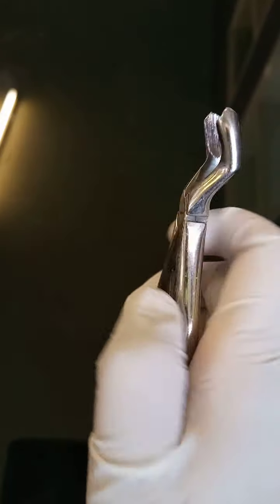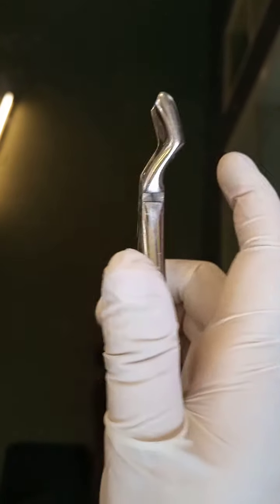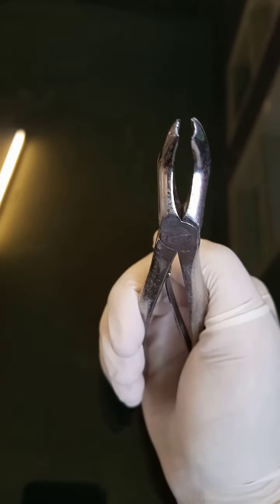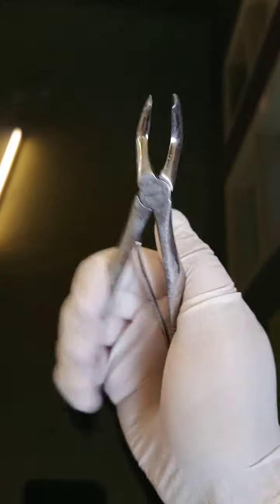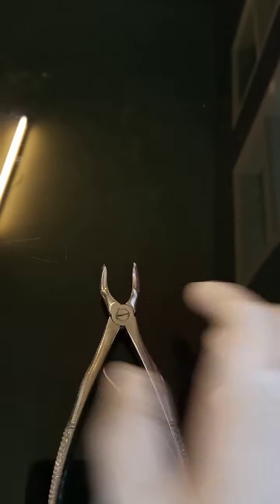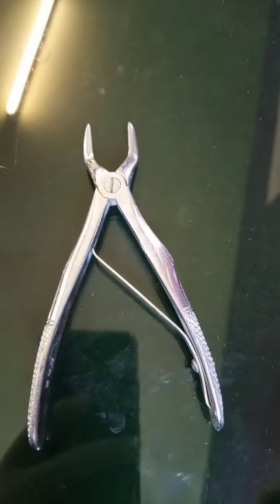The beak is beveled. I usually prefer this forceps for the extraction of upper D and E's in cases of uncooperative patients because it has strong grip. Now the next forceps shown is BDR forceps.